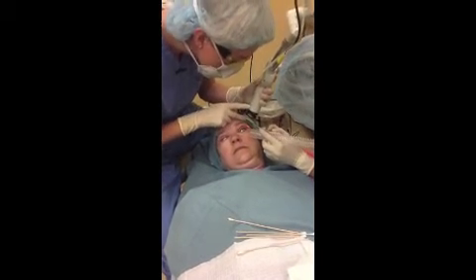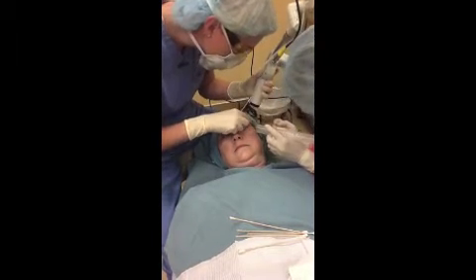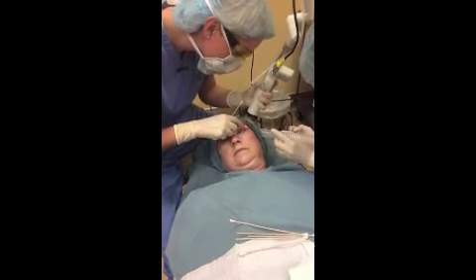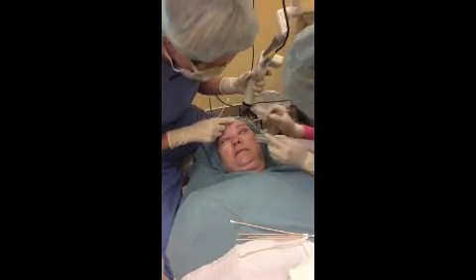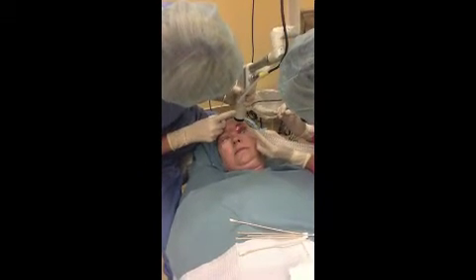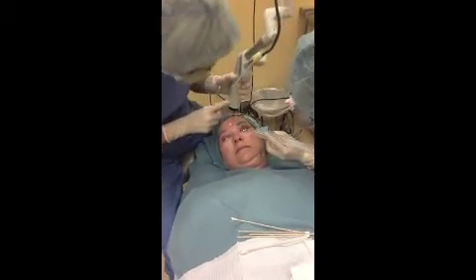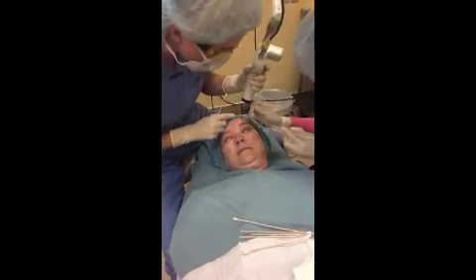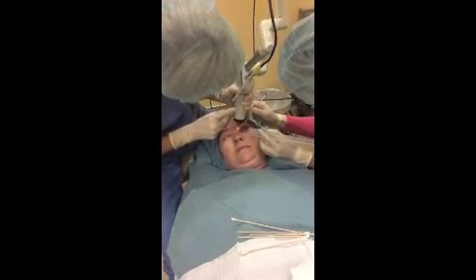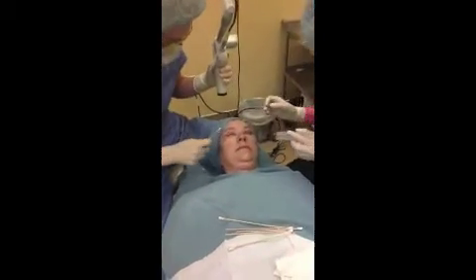A little bit right here. You can get that — that's the best case under there somewhere. You got it. I've lost it there. And a little bit right here. And a little bit right here. This side. You did great. One eye left.